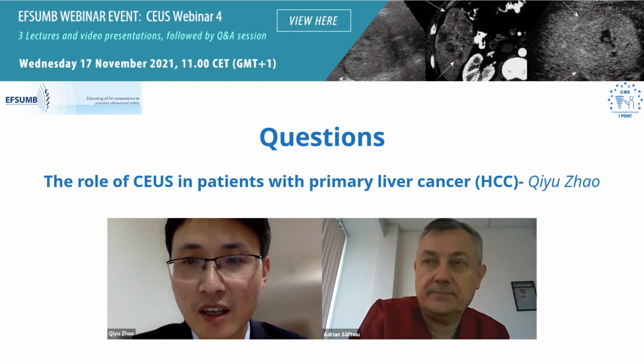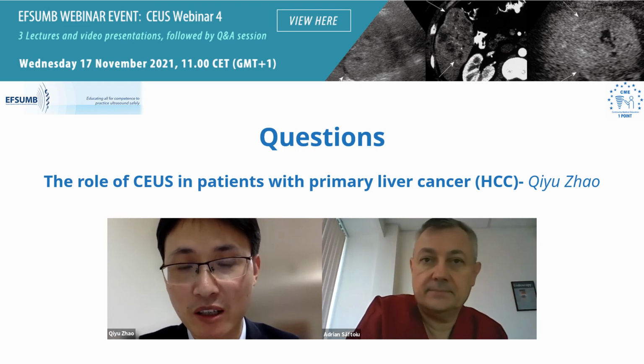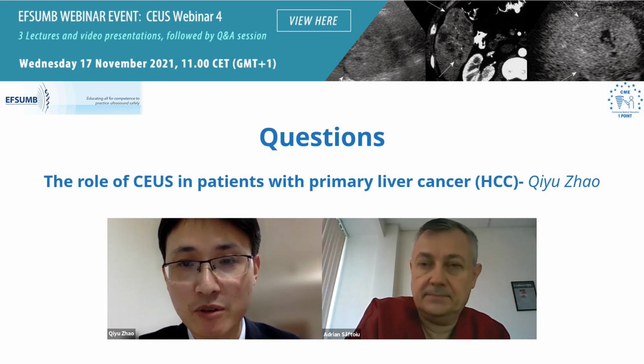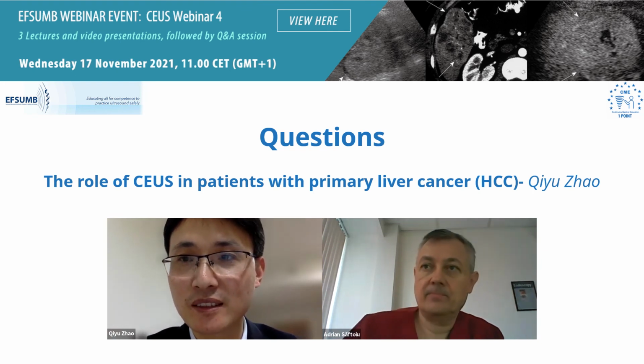Yes, CEUS can diagnose HCC in most patients or most nodules. And if the nodule is located in a safe location, and we can do the biopsy safely, we do the biopsy before the surgery or before the ablation. And if the location is very dangerous and high risk, then we will rely on CEUS or CEMR to diagnose the nodule.